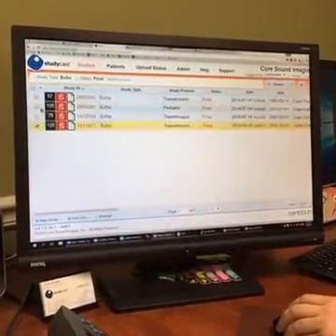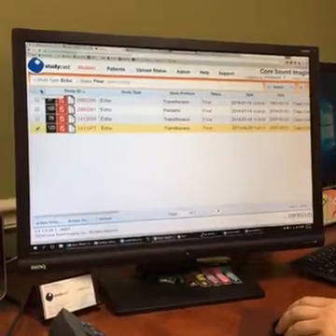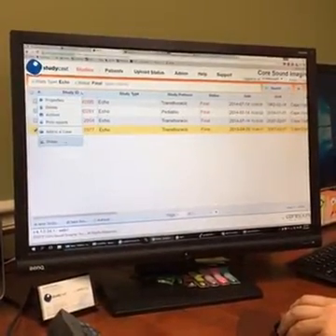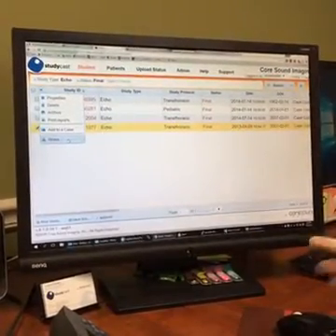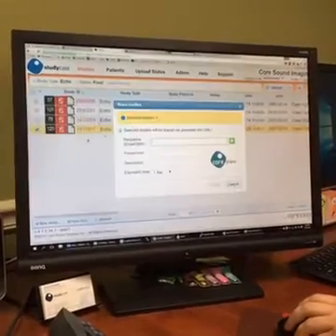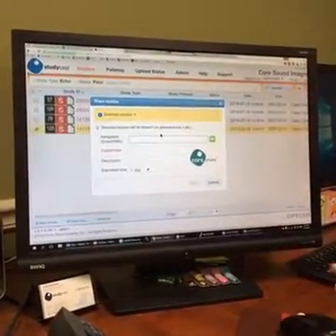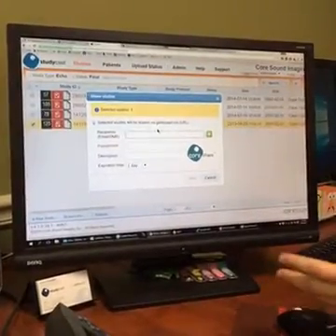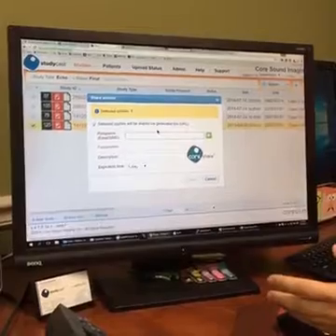At the top of this checkbox column there is a pull-down menu. If I select this, one of the options in here is Share. And once you have your studies selected, if you select this Share option, you will get a screen that gives you the opportunity to type in an email address. You can do one or multiples of who you want to send these exams to.